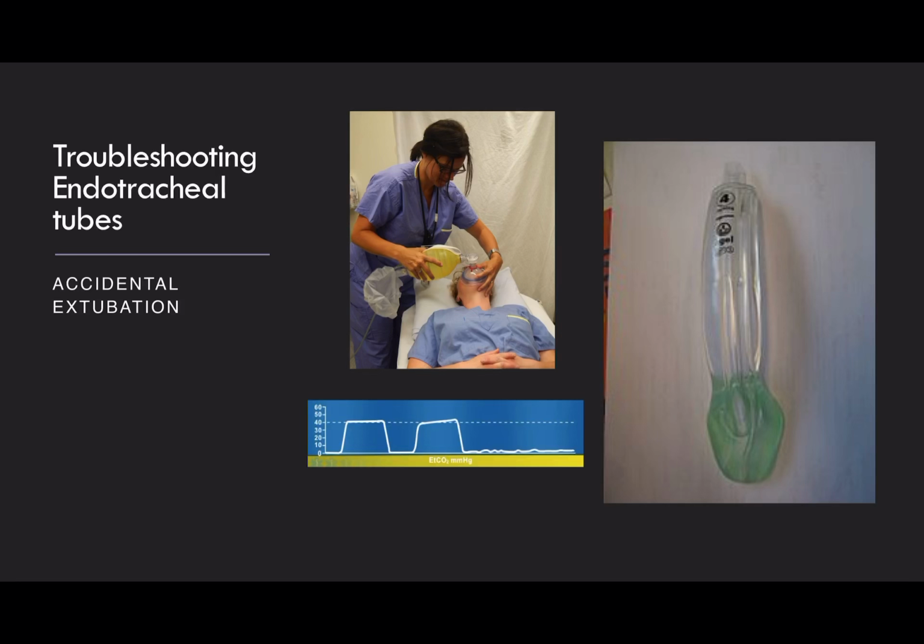Always check with the nurse and always look at the clinical situation, because sometimes end-tidal CO2 monitors recalibrate, and when they recalibrate you see this straight line for a short period. However, if you see that the end-tidal is gone, always assume that the patient is self-extubated and manage the patient appropriately. This might mean putting a Guedel airway in and using a bag valve mask technique, as you can see the nurse doing in the picture above.